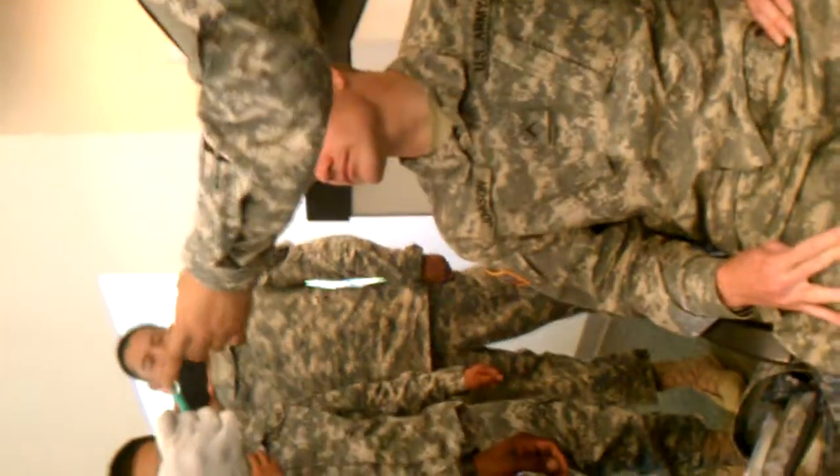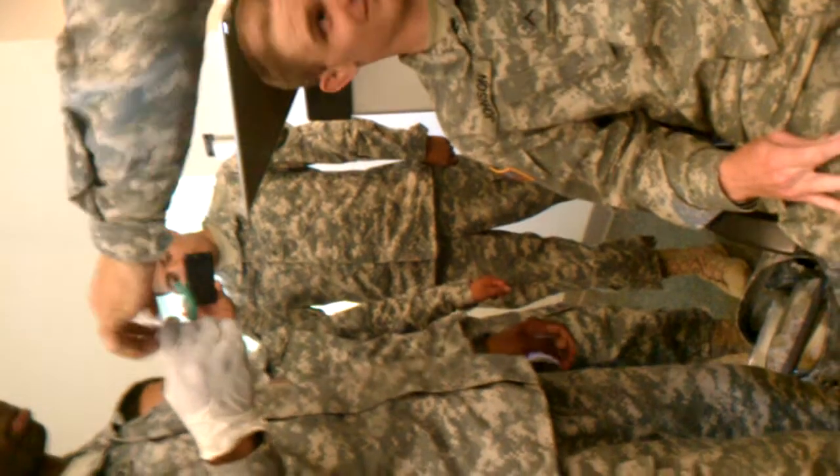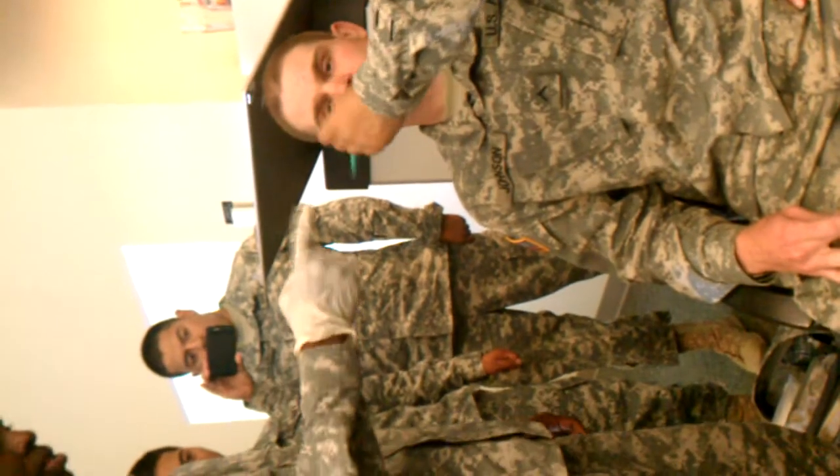Once you get it about right here — don't just ram it in. Once you get it about right here is when you actually start turning it. What you want, the desired effect, is for it to be like that. You're going to go in, get it about right there, then start turning it and go down.